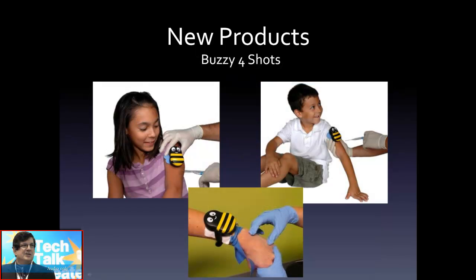As pediatricians, we're sensitive to the needs of our patients regarding reducing pain and making the experience a good one for our patients. So I was very pleased to learn that a pediatrician did some research on and developed a device called the Buzzy. The Buzzy is a little battery-powered vibrator that uses the gate theory of inhibition of ascending pain sensation. It combines this vibrator with a cool pack, and when you place it over the arm of a child, it really reduces the amount of the pain associated with needle sticks, procedures, suturing, etc.